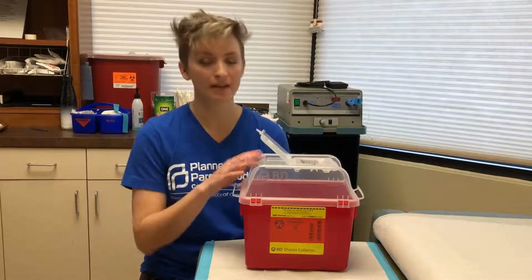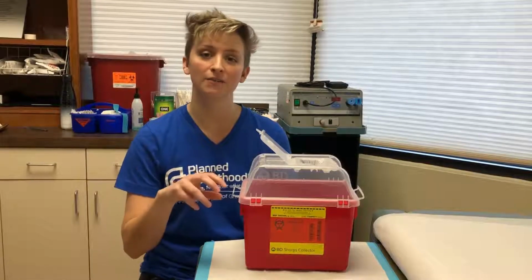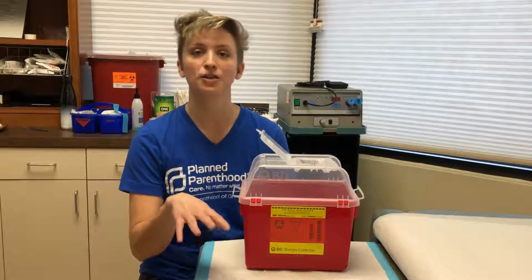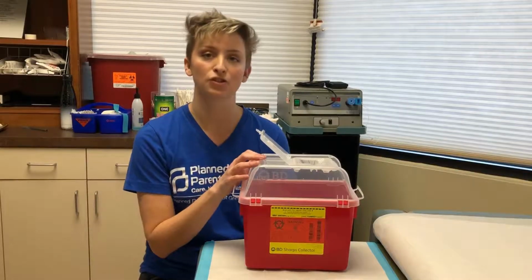To discard your injection supplies, you can purchase a sharps bin at the pharmacy. You can also use a laundry detergent bottle or a milk carton, something that's a hard plastic. As long as you write sharps on the container, securely fasten the top and put tape around that as well, you can dispose of that in your regular trash. All of your injection supplies are meant for single use, which means you use them once and then you immediately put them in your sharps container.